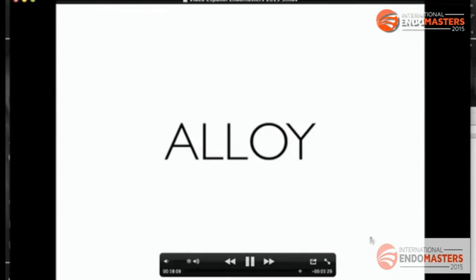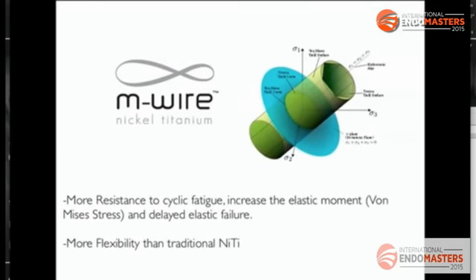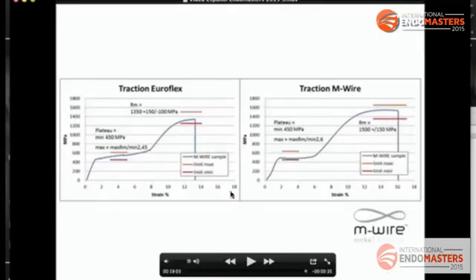Here we have another point, the alloy. The alloy is really important at this moment. We have different changes in the alloys of the files. Here we have, for example, the M-Wire. The M-Wire has 2 good points. The first is more flexibility in the file and also more resistance of the file to cyclic fatigue. Also here we can see a diagram of standard nickel titanium, and here a diagram of M-Wire. We can see how we can improve the resistance of the file until the break in the martensitic phase.